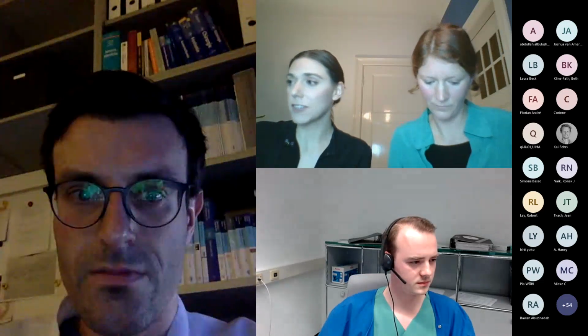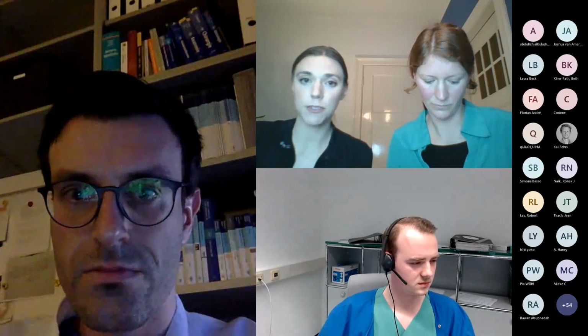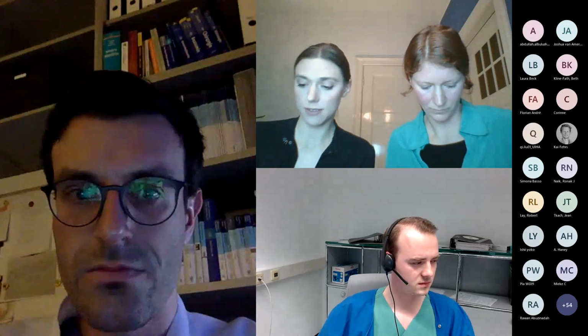Thank you. We have another question from Beth, which is, do you always scan after 30 weeks? Yes, every one of our scans is after week 30.